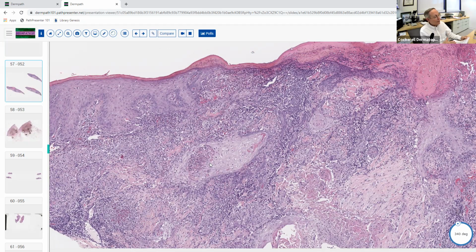They could have said a 60-year-old diabetic man, because these people are often immunocompromised for one reason or another. And they are from the Sonoran Life Zone area, from Arizona, Mexico. We see some of it in Texas and West Texas. So your best diagnosis here is obviously cocci. It's not crypto. Remember what crypto looks like.